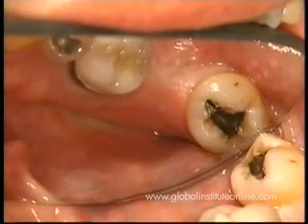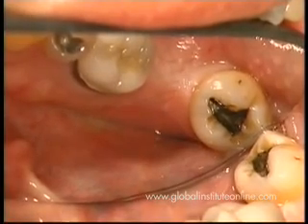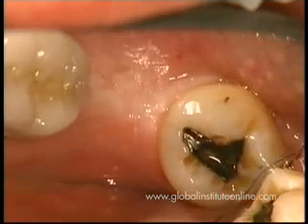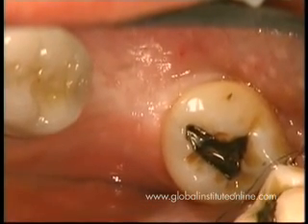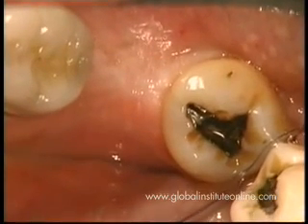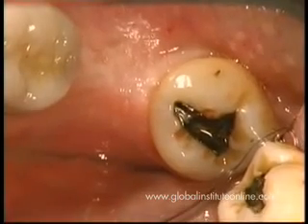The clinical appearance, as you can see here, most importantly, is really to preserve the gingival tissues as well as to stay within the bone. So it's very important to diagnose these patients, which we're going to use the flapless procedure, to have sufficient bone and sufficient soft tissue.